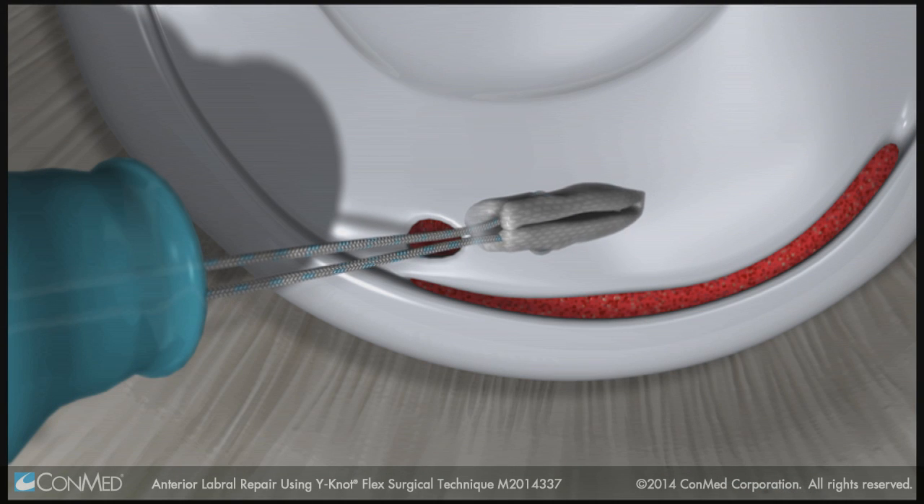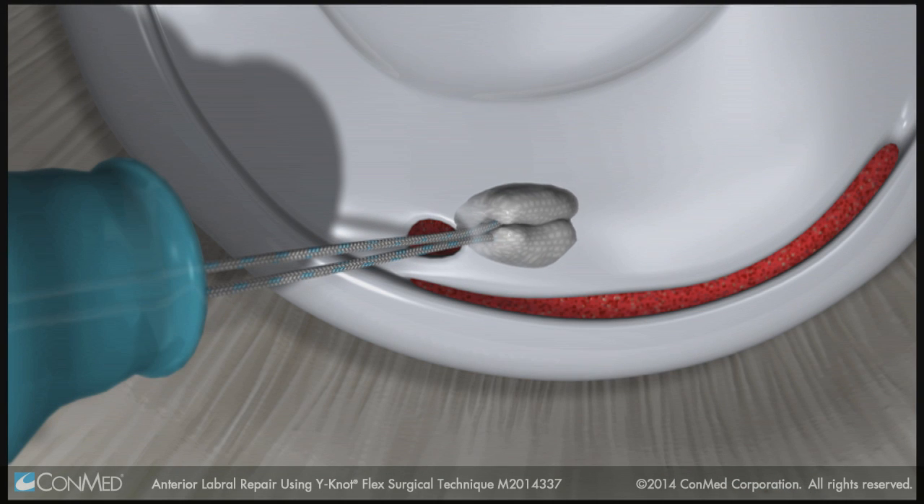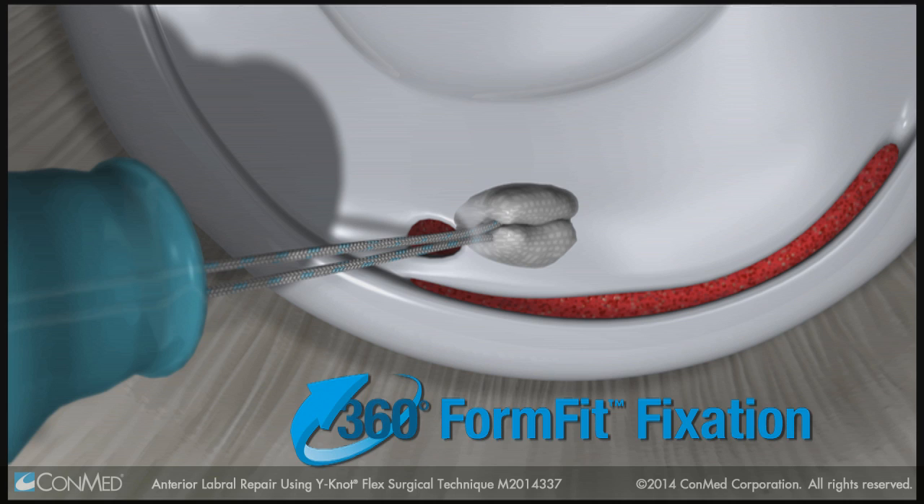Then pull back on the sutures to deploy the anchor. The anchor expands laterally and is secured against the cortical bone using 360-degree form-fit fixation.